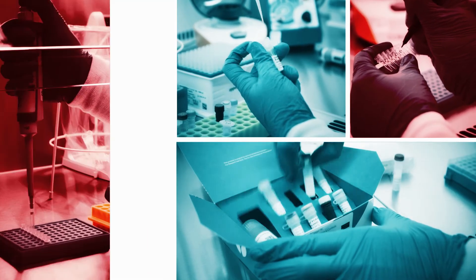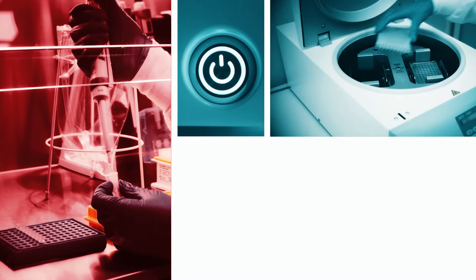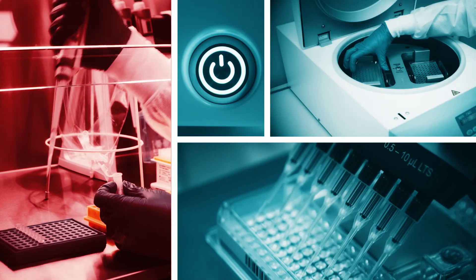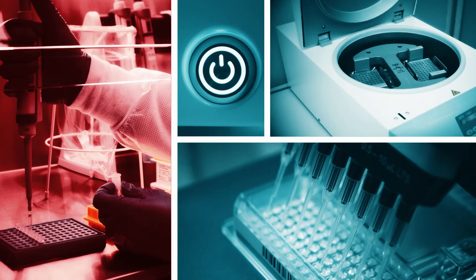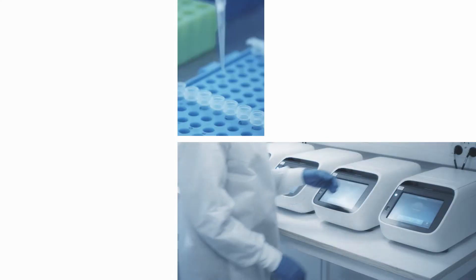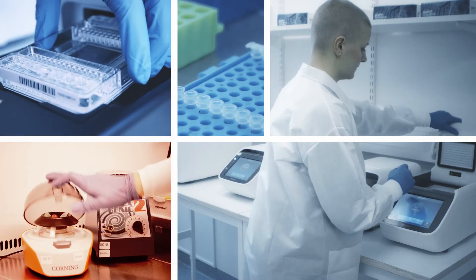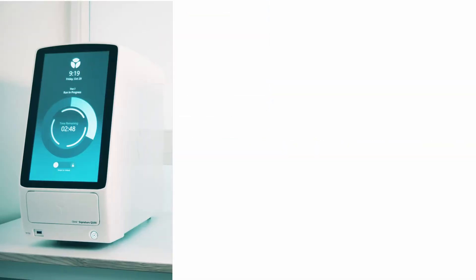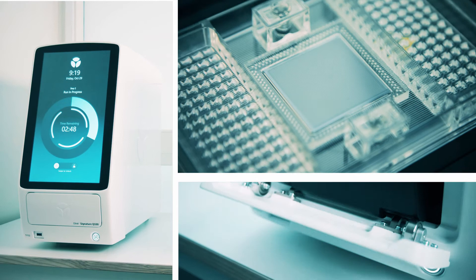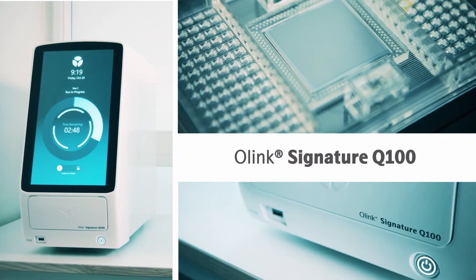We offer high-quality protein analysis through our validated O-Link target multiplex panels. Now you can run these panels in your own lab with our new benchtop instrument, O-Link Signature Q100.